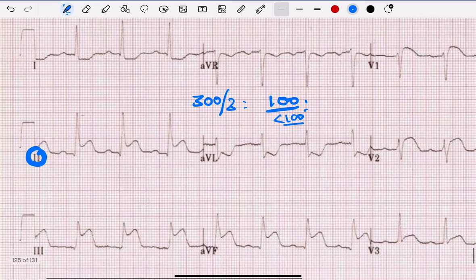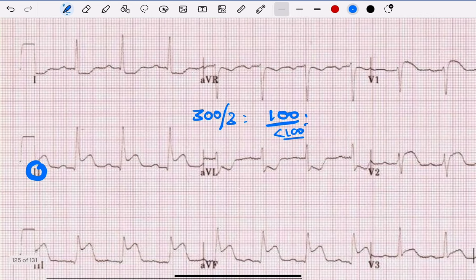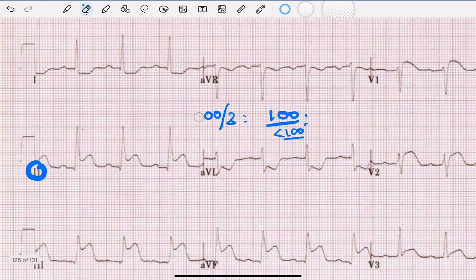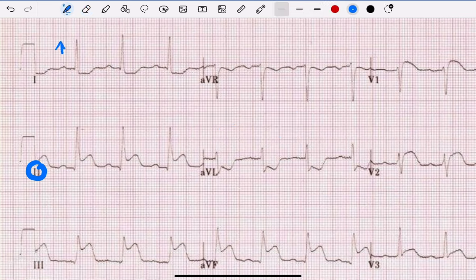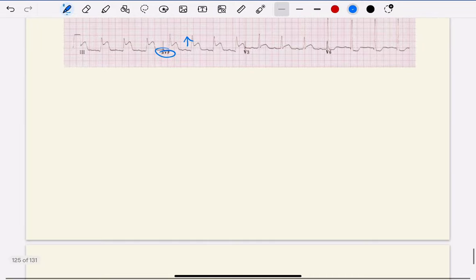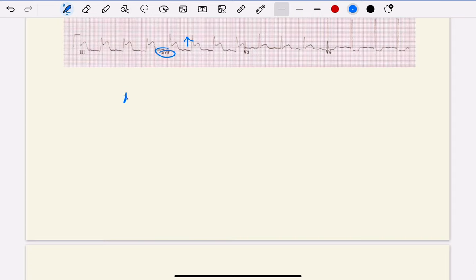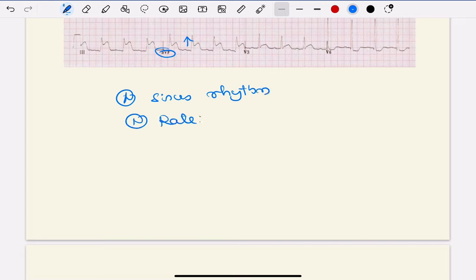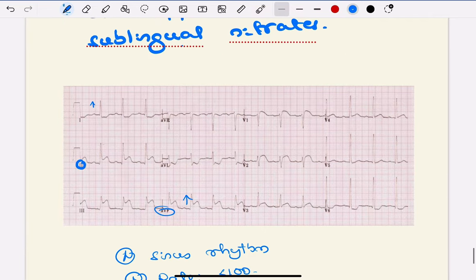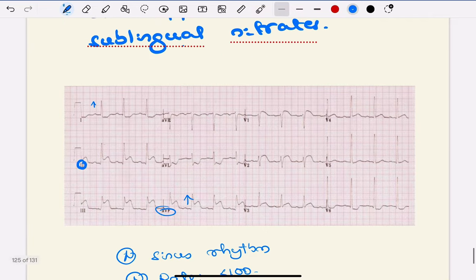Now we calculate the axis. For that you have to see lead I and lead aVF. Both are up, so normal axis. Let me write down the findings: normal sinus rhythm, normal rate around 100 or less, and axis is normal. So till now it is normal.